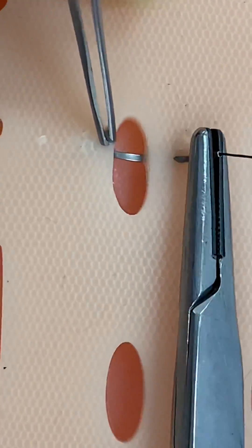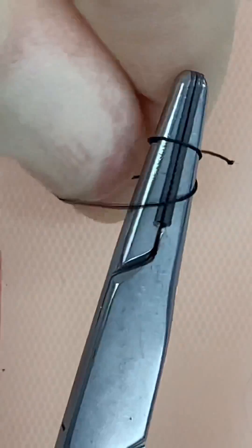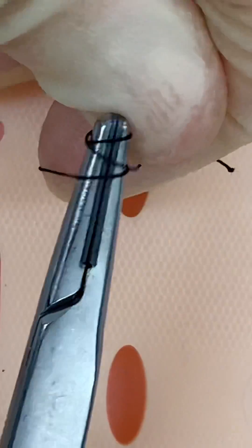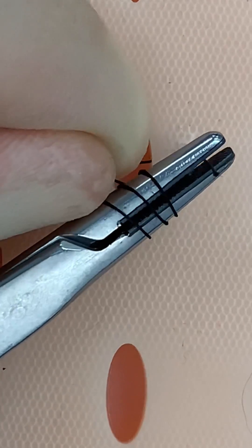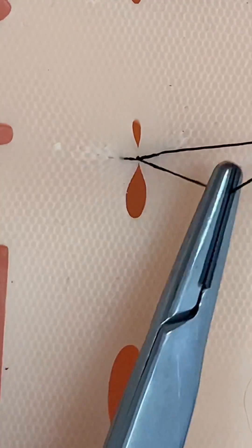Here's why most surgeons use special tools to tie their knots. This is called instrument tying, and here I'm using it to tie a triple throw surgeon's knot. Three throws of suture material are placed on the needle holder and the short end is pulled through. This knot helps pull together high tension wounds, as more throws means more friction.